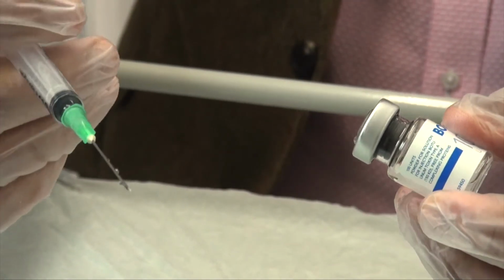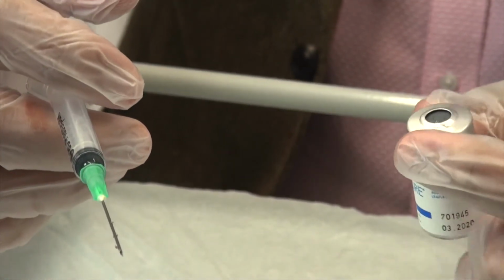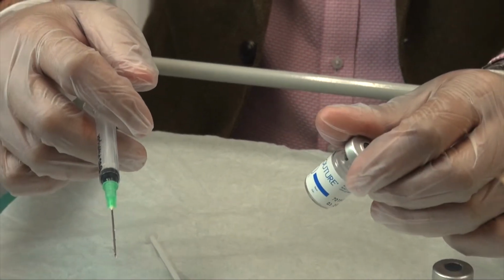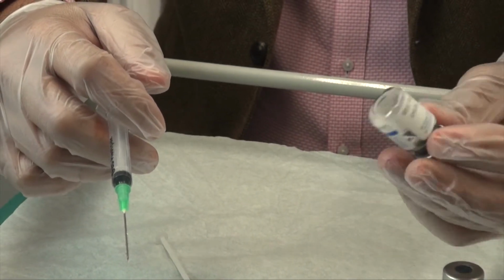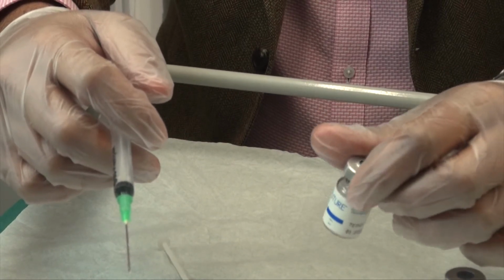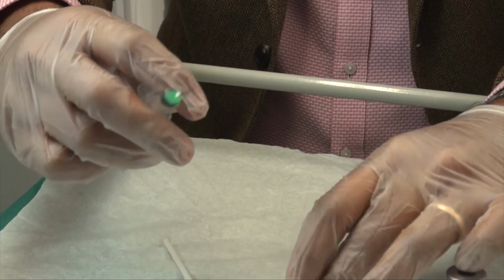You can see there's a tiny little squirt there of toxin as we remove the needle, but not really any significant amount. And now we have 2.5 mils of bacteriostatic saline and 100 units of Bocouture in that 2.5 mils.